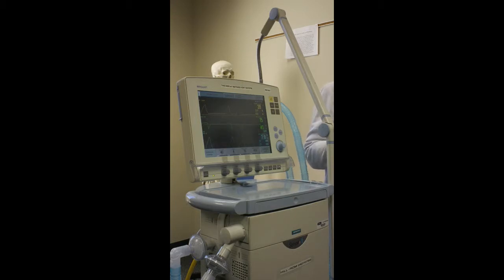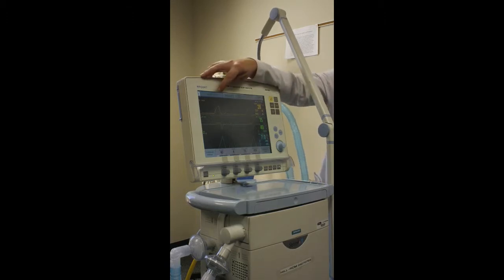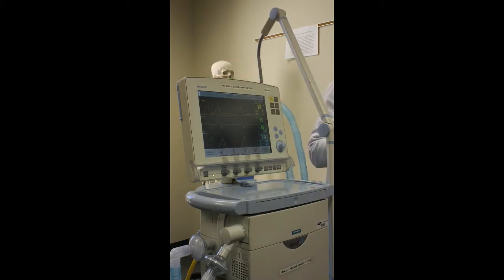Mandatory respiratory rate is the set rate on the ventilator. So right now this one's set at 15, so 15 would go there. And we're in ACVC, so we would put ACVC. We're in volume control, which is ACVC. Tidal volume, set tidal volume. If you're in a volume control mode, you're going to have a number here. We're set in volume control, so we're at 450.